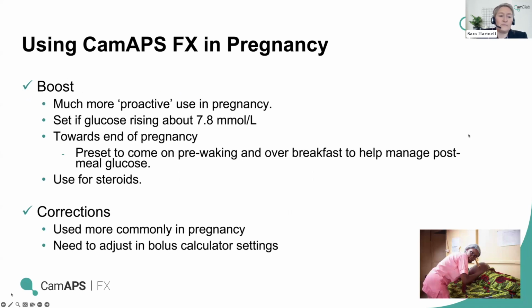Candice talked about the use of boost and ease off and saying they're for special occasions. We don't want to overuse them. When it comes to pregnancy, we use boost as and when it's needed. We're much more proactive with the use of boost. The real thing we want to achieve is to keep that glucose level below 7.8 millimoles per litre post-meal. And so we encourage women to be super proactive when it comes to the use of boost. Just put it on if you need it. Even if you're in the target range still and you can see you've got up arrows and you think, I'm unlikely to stay below 7.8, pop it on.